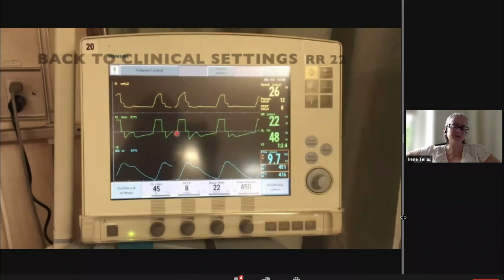So here is, we're finishing with it. That's why I'm taking some time. So again, this is insufflation, positive in the flow, and then we have here the exhalation. So this patient is on volume control ventilation, and all the breaths are triggered by the machine. You see there's no change in the color here, and there's no negative deflection at the beginning of the breath. But we have this very clear deformation during exhalation. This represents a patient's inspiratory effort occurring immediately after the machine insufflation. The P0.1 value provided by the ventilator might be misleading in this particular case, okay?